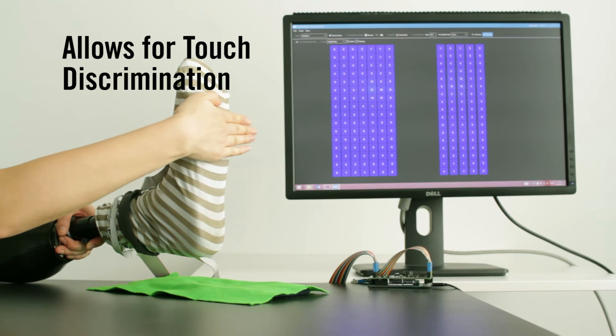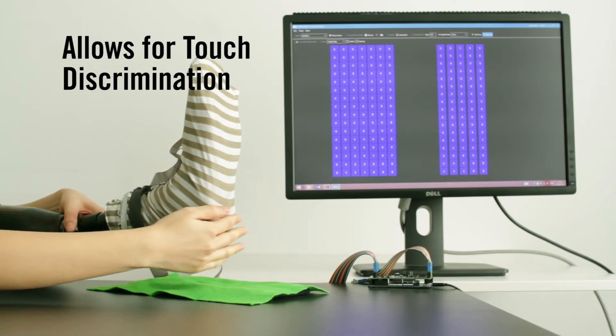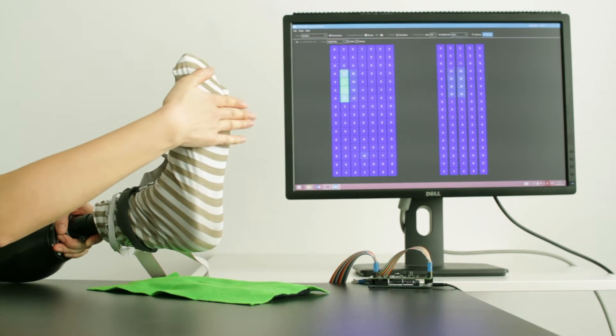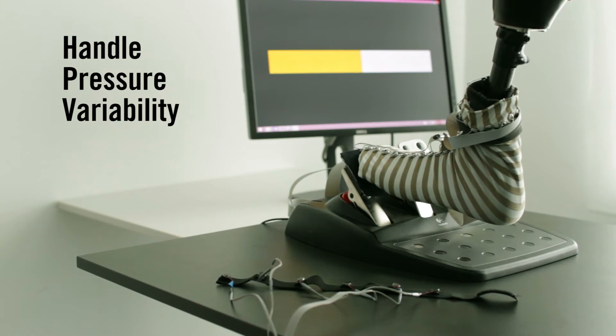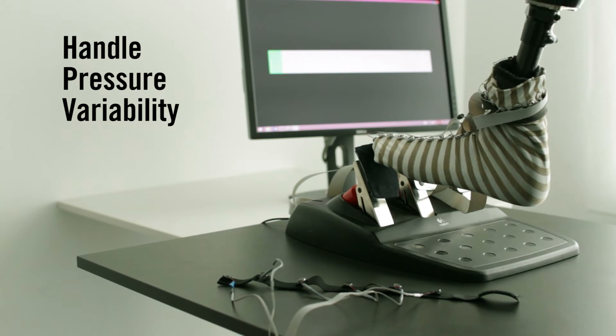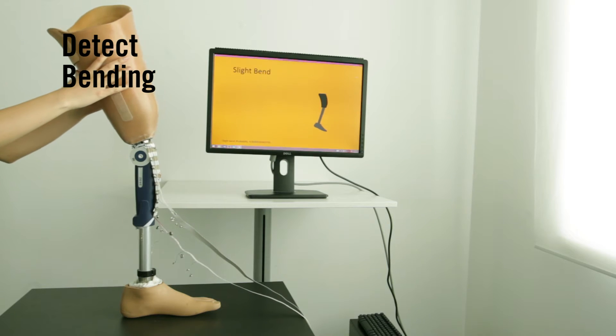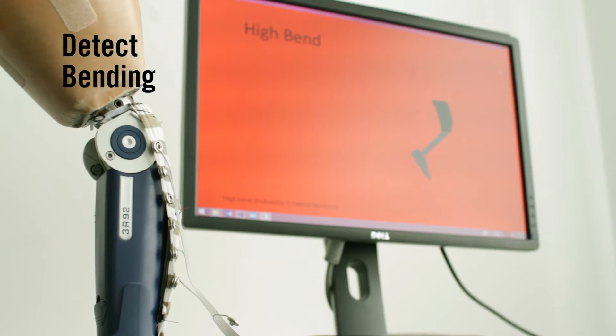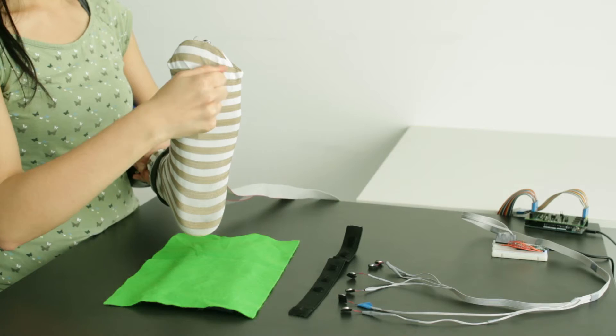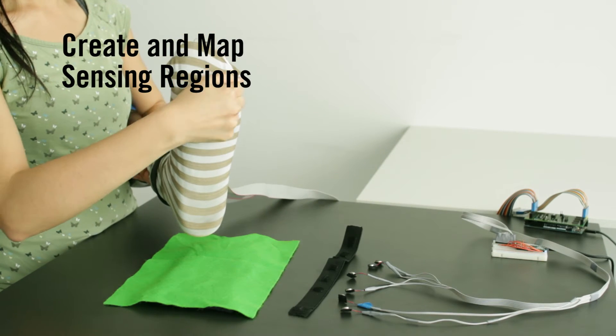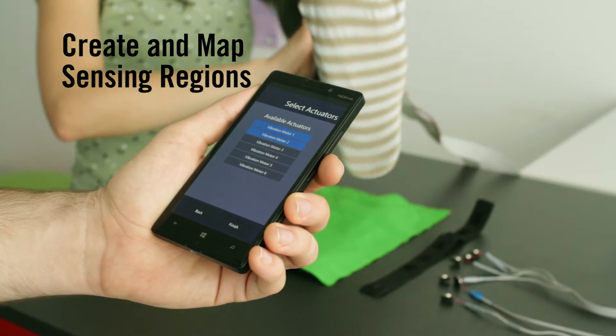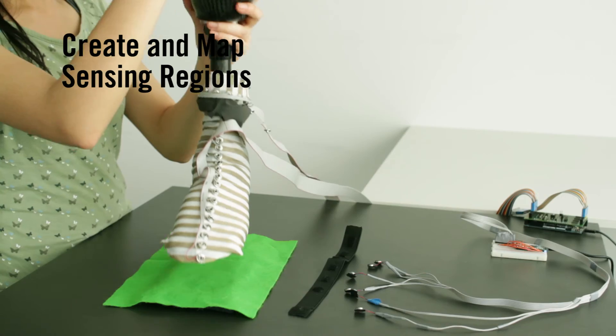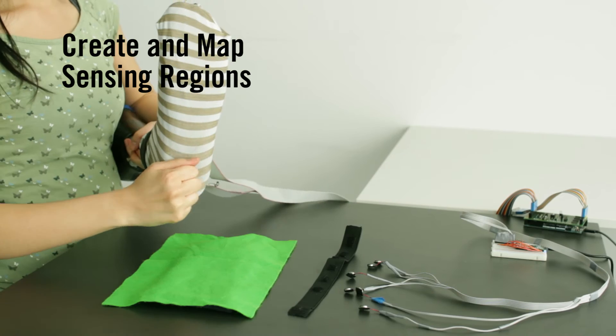ProCover can allow for touch discrimination between different areas on the foot, can handle pressure variability, can be used to detect bending in prosthetic joints, and empowers users to dynamically create and map sensing regions on the foot to feedback actuators via mobile app.